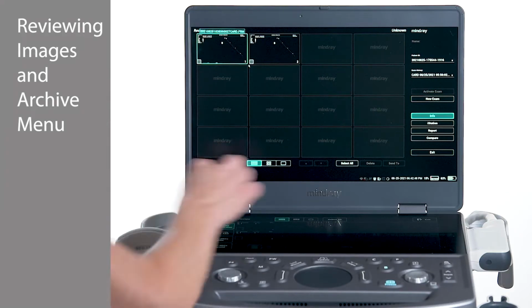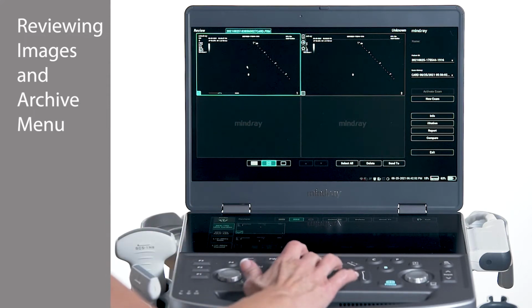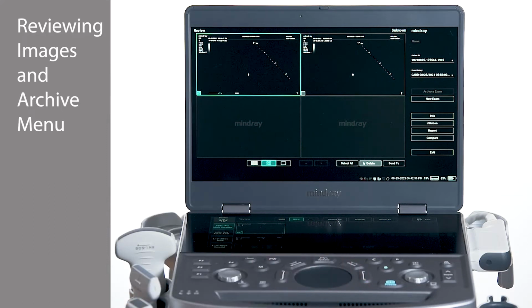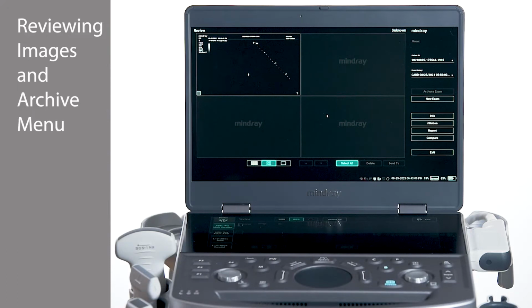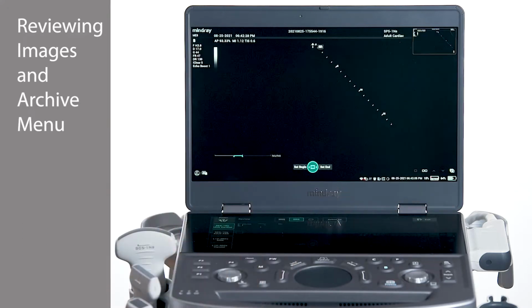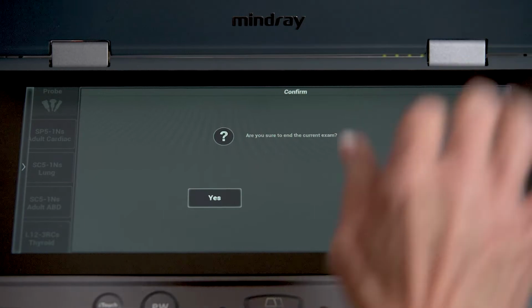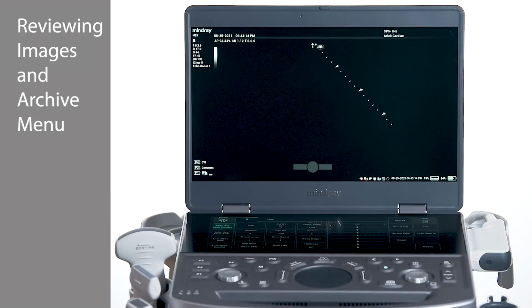Images may also be deleted from this location by selecting the image and choosing Delete at the bottom of the screen. Post-processing may be performed on prior exams, such as adding annotations or measurements. Once all necessary changes have been applied, select Exit to return to the main imaging screen and select End Exam. If the system has been set up to transmit images to a PACS, images will automatically send when selecting End Exam.